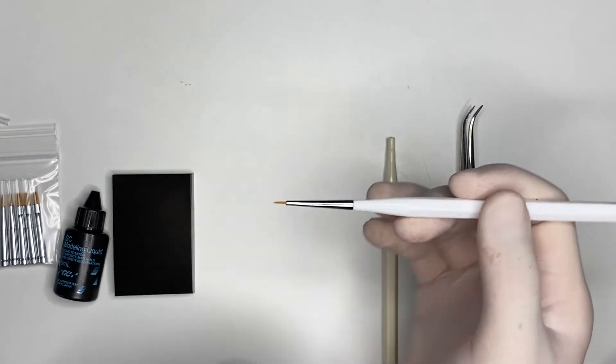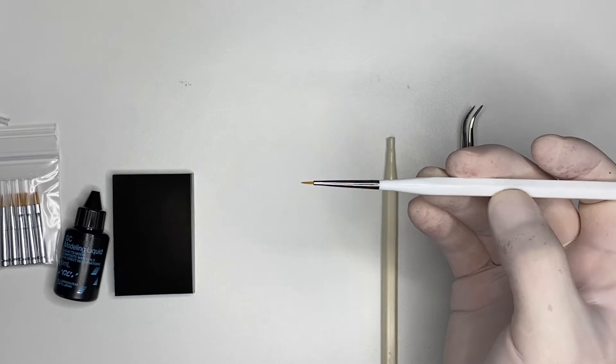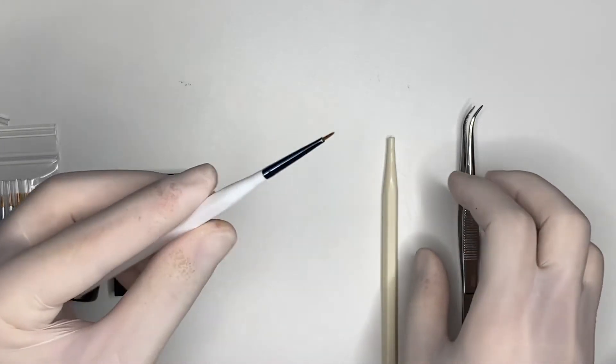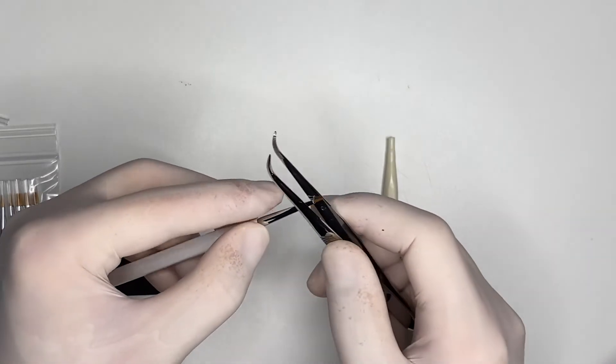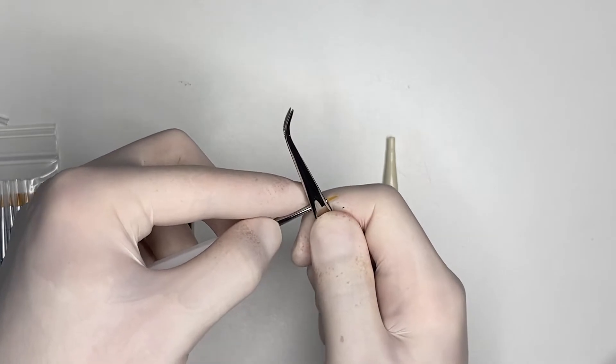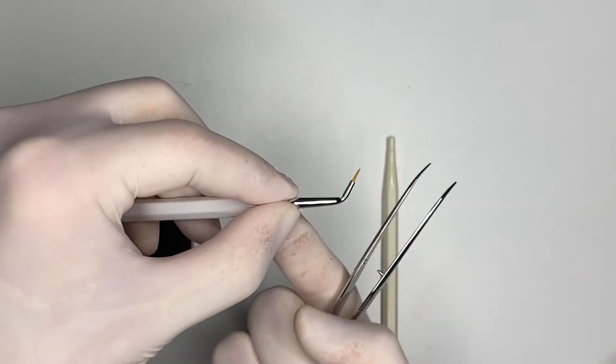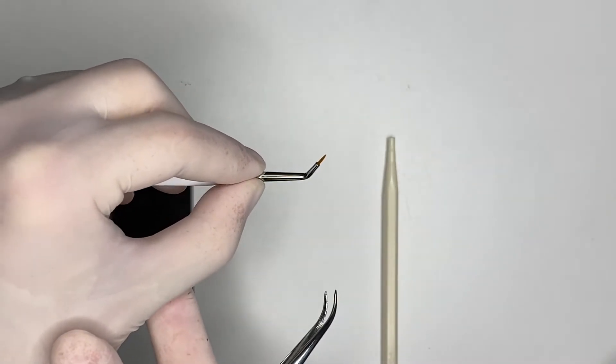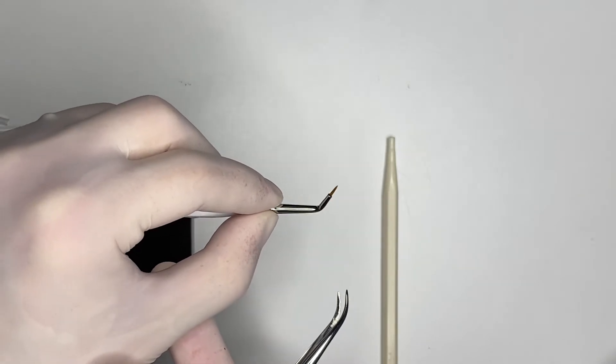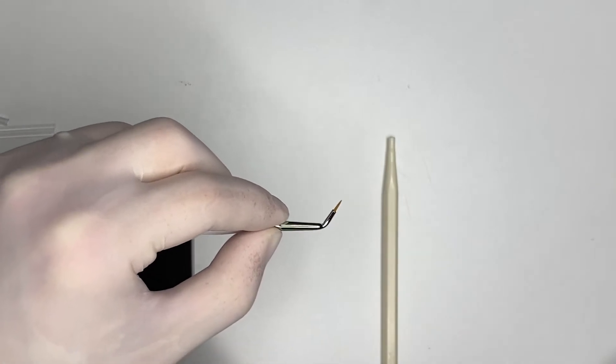But if you use your plier and you pinch the round brush next to its bristles, and then you angle it at a 45-degree angle, you're going to have plenty of access for your occlusal cavities on the lateral teeth.